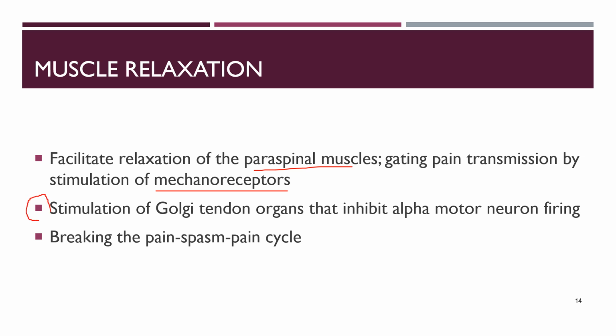Whenever we're setting somebody up on mechanical traction for muscle tightness, stiffness, we're really trying to stimulate those Golgi tendon organs. Okay, so if you remember what these Golgi tendon organs are really meant to do, right? They're meant to respond to tension in the muscle or tension in that musculotendinous unit, and that prolonged tension forces relaxation of muscles. So that's really what we're trying to do here.